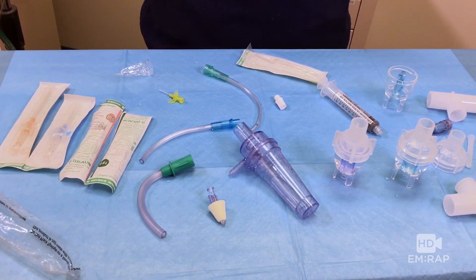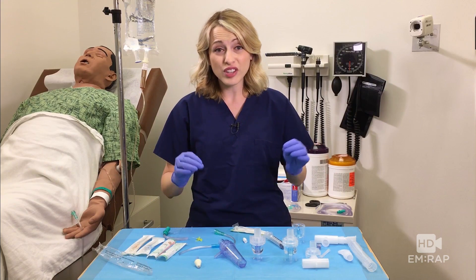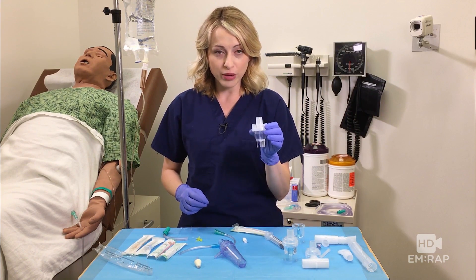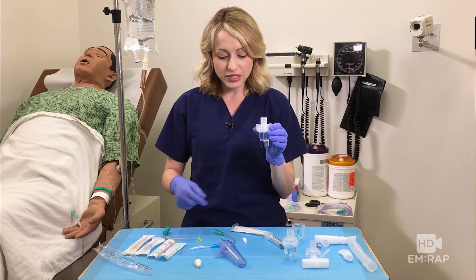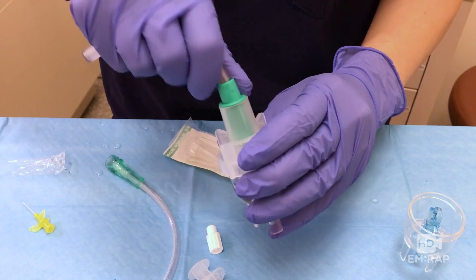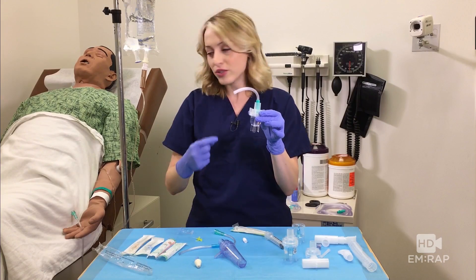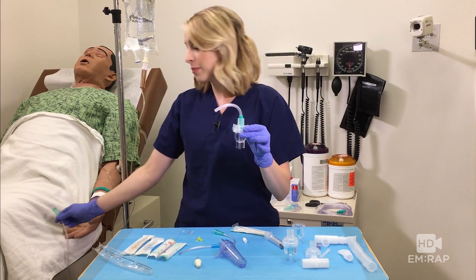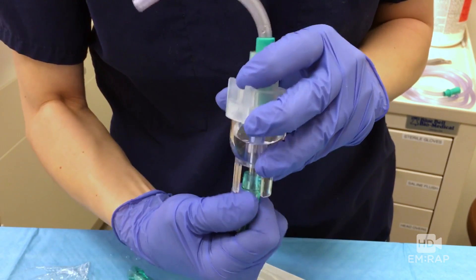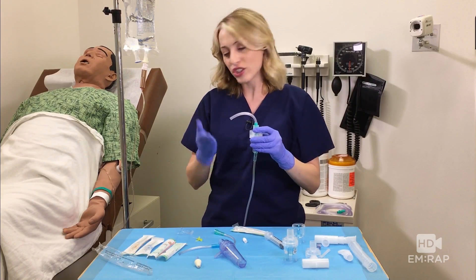We tried a whole bunch, as you can see, and it turns out it doesn't work as well as I was hoping. Let me show you why. If you take a nebulizer chamber and connect it to either oxygen tubing — or in this case suction tubing, which we found fit a little bit nicer — you place that there, and then you connect this end to oxygen. Thank you Adam. Just like you would if you were nebulizing something. Let's turn this on and take a closer look at what actually happens.